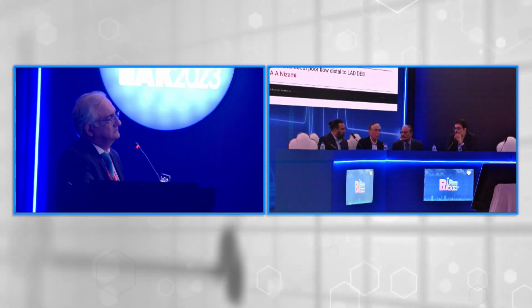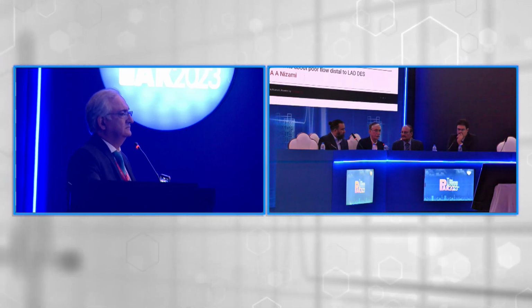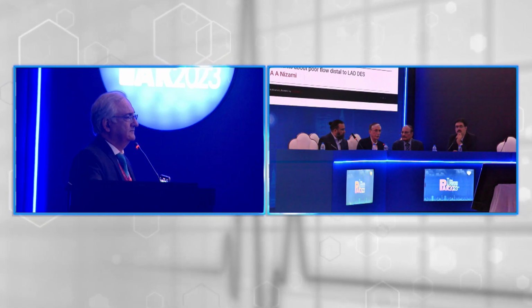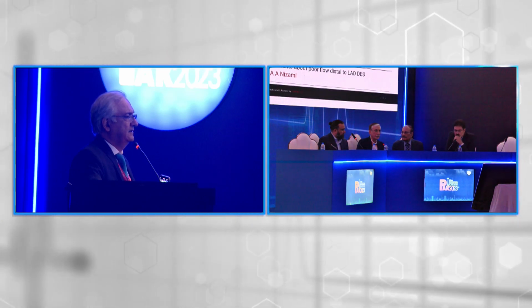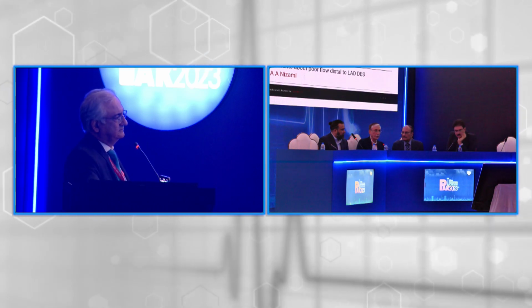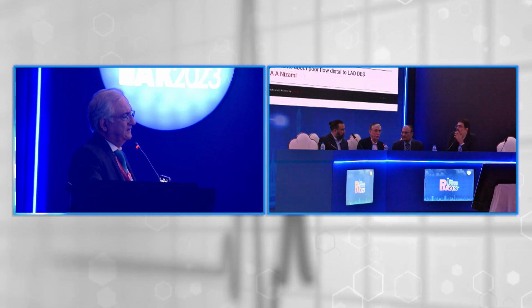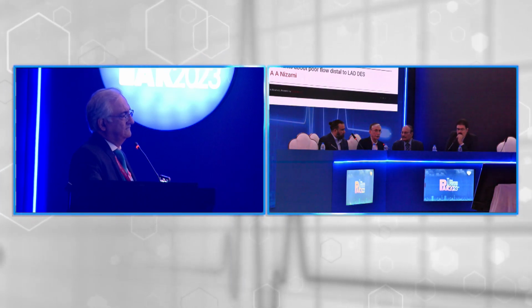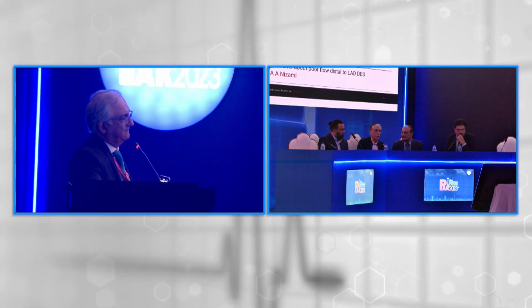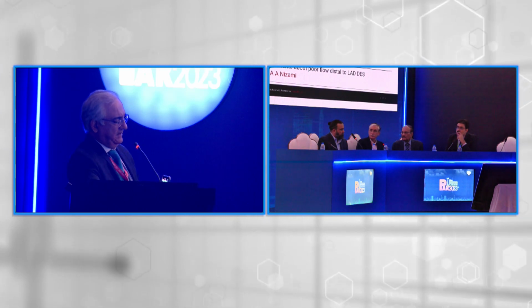So a lot of planning, discussion with the patient, discussion with the colleagues, and then laying out your strategy and having the proper hardware is extremely important, plus all the tools to avoid and manage complications, especially perforation, because the risk of complications is higher in CTO PCI than in any other form of intervention of coronary arteries. So one has to be prepared for that.